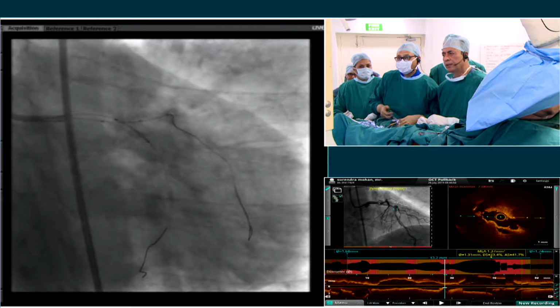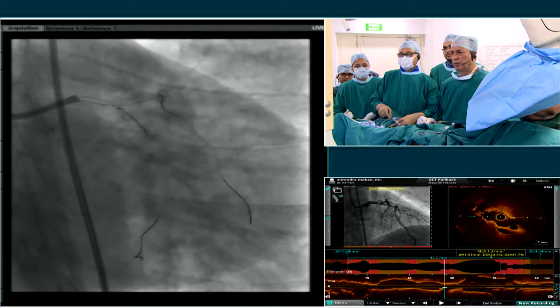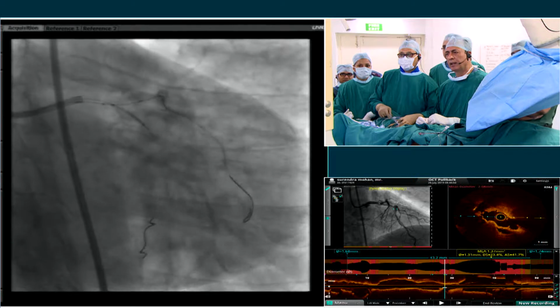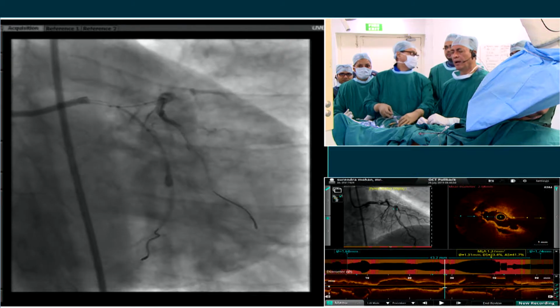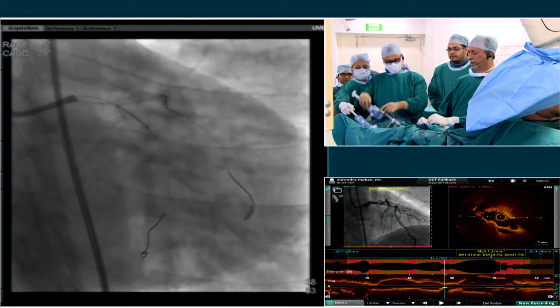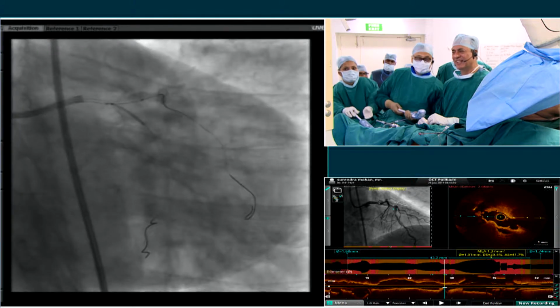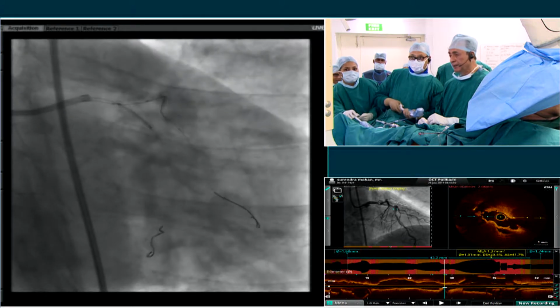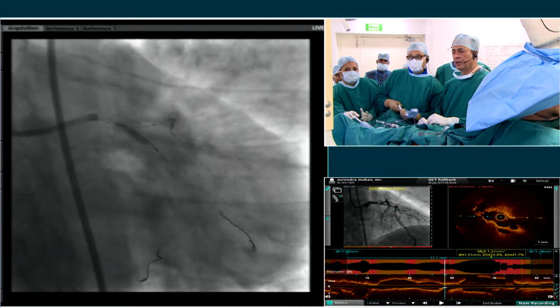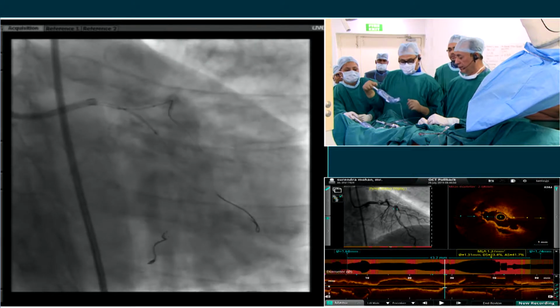The stent to circumflex, ideally it should be 1 or 2 millimeters into the left main, just inject a little. So if you're picking a 2.5 stent, you have to make sure you know the sizing matrix of the stent, because that circ could be as big as 3.5, and not all the 2.5 stents will go up to that level, and so then you'll end up with an undersized stent in the ostium of the circ. No, it doesn't look that big. It's just 2.5. We'll check it. I'm just making the point to the audience. Yeah, that's all fine.